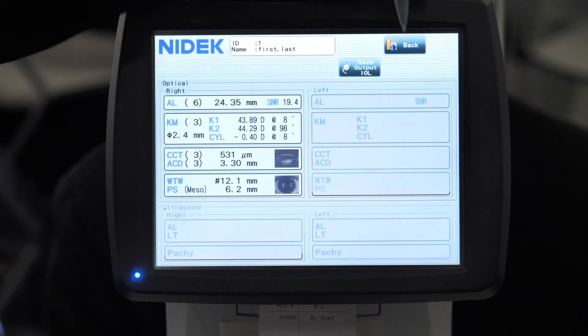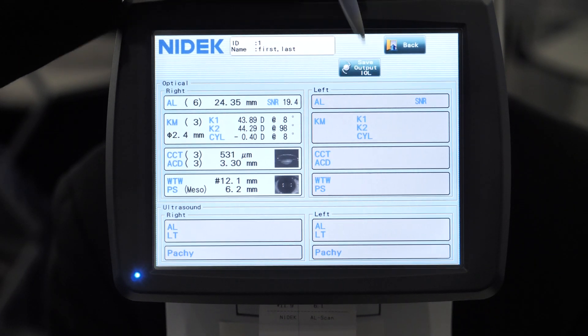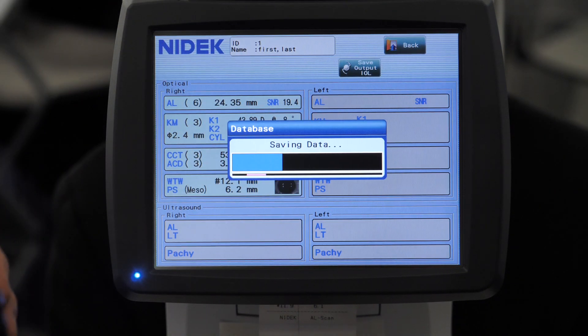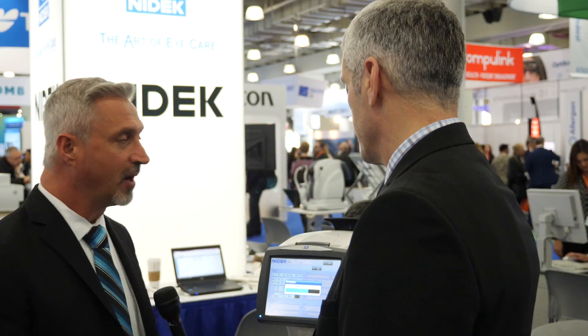Once you're finished reviewing your data, you can click on save output to IOL. What this is going to do is save the data for you internally, and it's also going to give you a printout. This can also be networked to your office network, and the images and the data can actually be sent out to your EMR system.